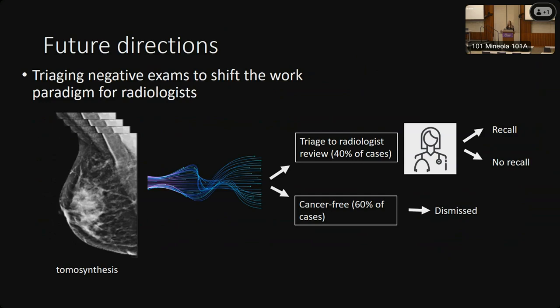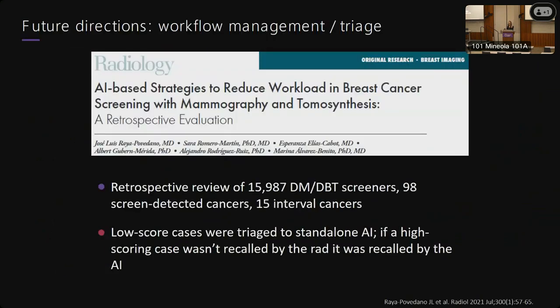So we are not here yet, not to scare you. There's obviously a lot of legal ramifications, forget about billing and reimbursement ramifications that have not been sorted out. But I think the research shows that this is very promising, actually. So I'll show you, this is a large Spanish study where they retrospectively went back and looked at 16,000 exams and then ran this model to see what would have happened.